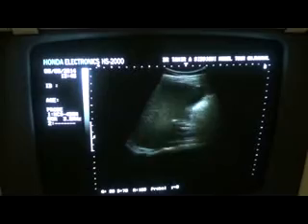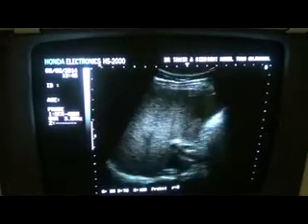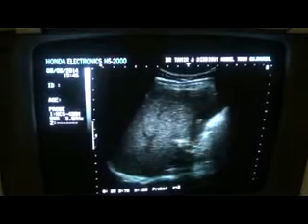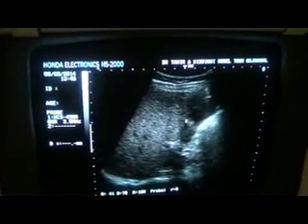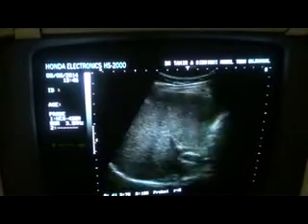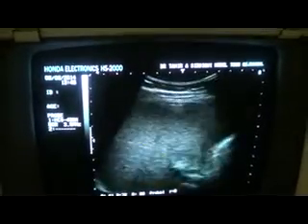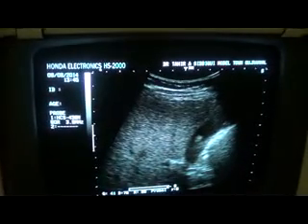Now, what is the benefit of, at times, enlarging the image and then scanning? Now you see — what is this area? This is the anterior wall of the gallbladder, and this is the posterior wall of the gallbladder. I am going to magnify further — it becomes clearer to you.